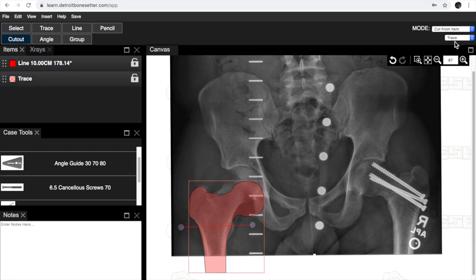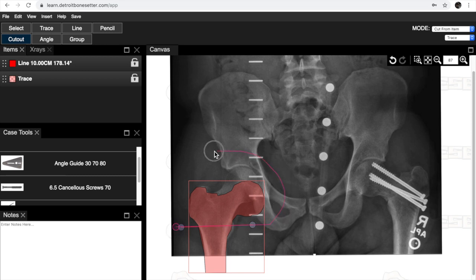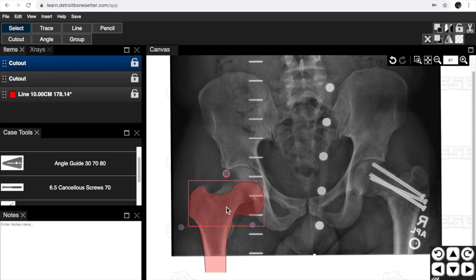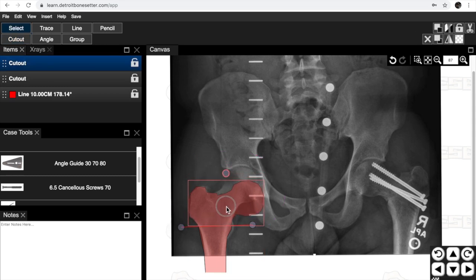We're going to come up here to the scissors and then we can make a mark across the line. Then you just have to encircle the part that you want to make the osteotomy about. And now it's two pieces.